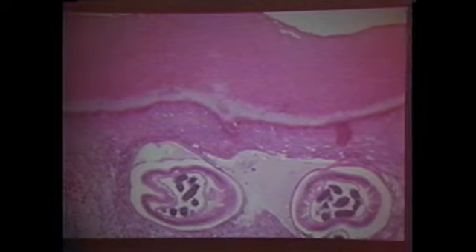This is Anatrichosoma in the skin of the hand of a monkey. Notice it has hypodermal bands. The female has one reproductive tract, but it has a lovely stichosome. Is that pretty or not? There's a stichosome. Look at the esophagus lumen right there. And here's an egg of Anatrichosoma that you can find from scrapings or sometimes passed in feces. And you can also find these in tissue sections themselves. And Anatrichosoma has an egg with a larva.